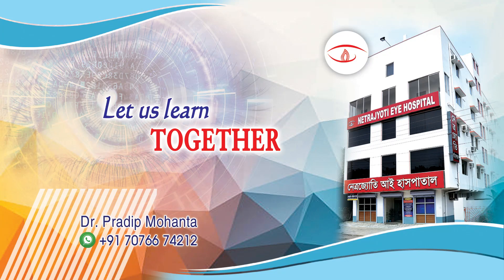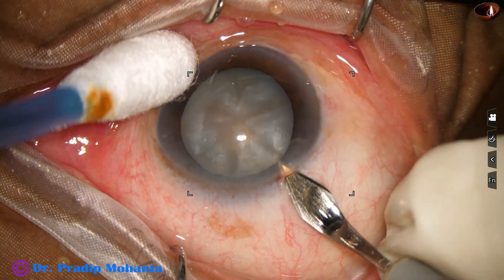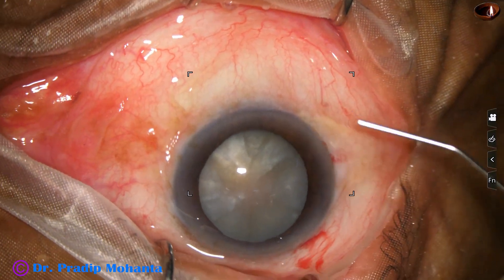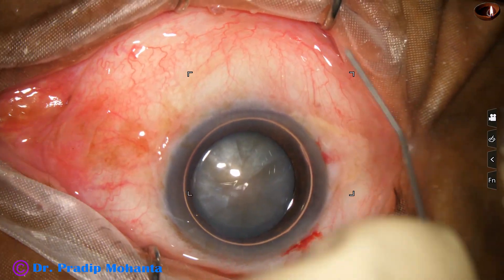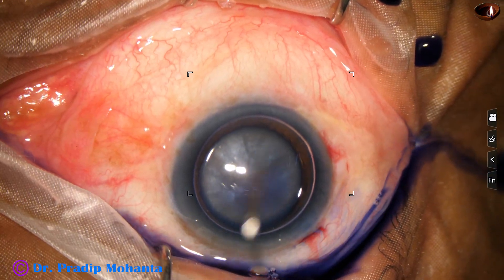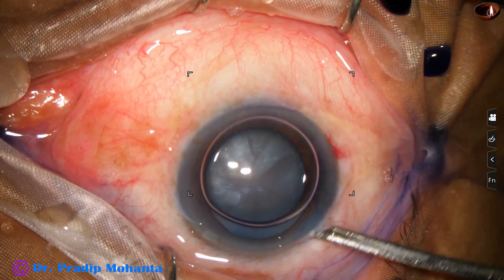Friends, welcome to my workplace for hands-on phaco and SICS training. This is an edited video. The nucleus management part is in real speed; other parts are at two times normal speed. This is to shorten the length of the video. The surgery took 12 minutes and has been edited to less than 9 minutes.